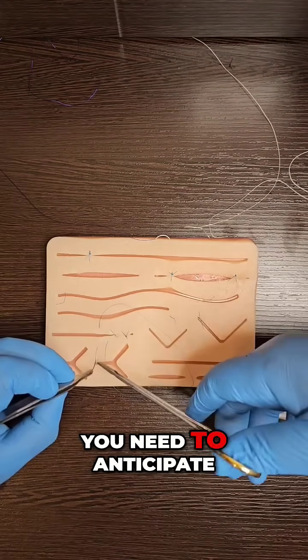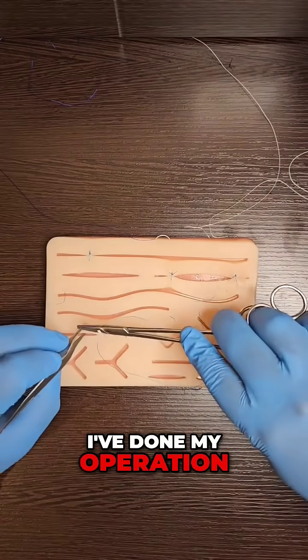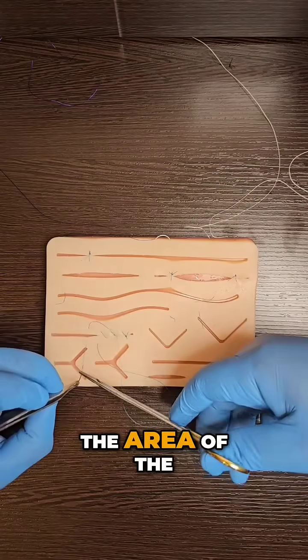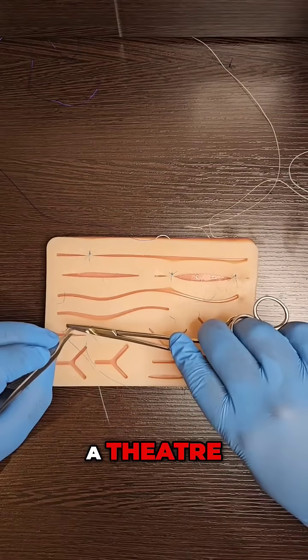You need to anticipate your next steps. At this stage I've done my operation, I need to start thinking about what comes next. What comes next? Naturally, it will be cleaning the area of the surgical field. So I need a wet and a dry swab. And if I'm in a theatre, I'll also ask for dressings.